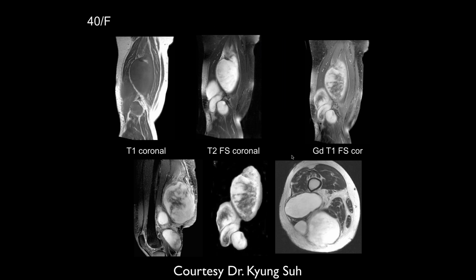All right, so 40-year-old female with multiple sequences of the posterior knee, the thigh. There are several large lesions which are low signal intensity on T1, high signal on T2, and heterogeneous enhancement on post-contrast images. Now, there is some little high signal on the T1, but it's predominantly low signal. But if you look at it, it's a little bit inhomogeneous, and there are some areas that are kind of high signal intensity within it. But it's very inhomogeneous on the other sequences. And you can't see it here very well, but there's kind of inhomogeneous enhancement. So it's pretty much a solid mass, right? Because it's centrally. Yep. I agree with you.